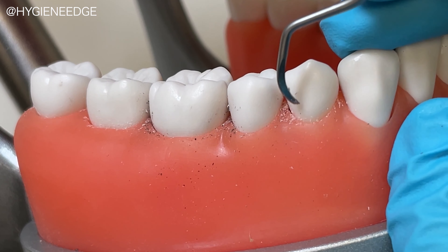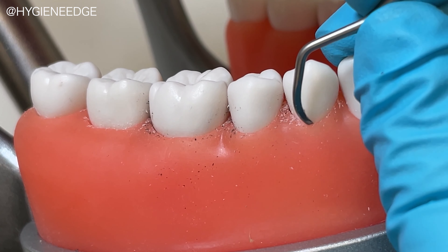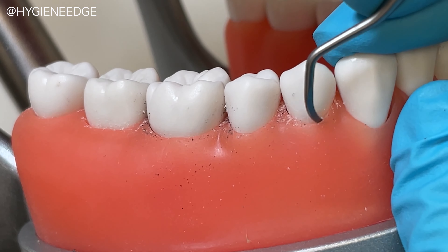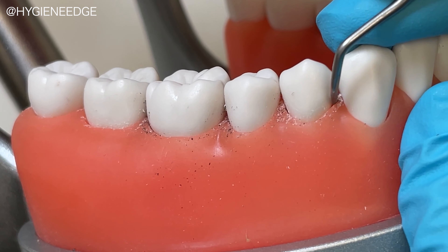It's highly beneficial to use this model early on to prepare for licensing boards as well. If you're feeling lost on how to improve your clinical skills or have a calibration meeting with the dental professionals in your facility, a typodont like this one is the answer for you.